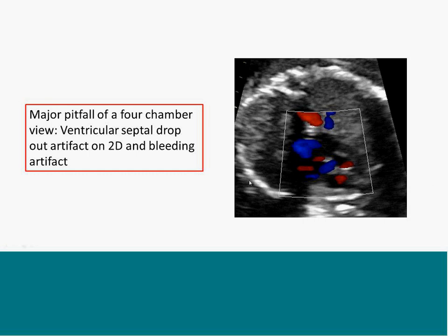So whenever you see it in a 4-chamber view, you always make sure that you go into the outflow tract and double check it, or you change the position of the heart, in the sense that if you get an apical or a basal view compared to the 4-chamber, you could make sure that the defect is not there. So always make sure that you see it in other views before concluding that it's a muscular defect. These are very commonly seen in the muscular septum, which are false, and also in the membranous septum.